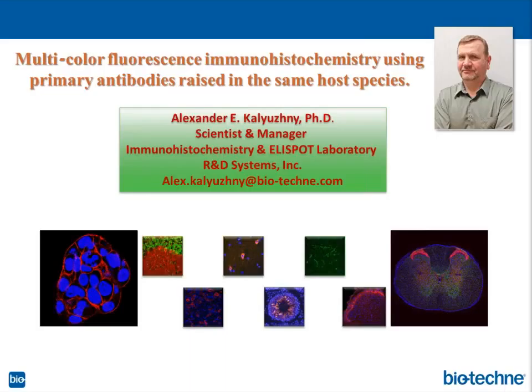We know from published papers that in frozen tissue sections, antigens are preserved better than in paraffin-embedded ones, and that's understandable because when tissues are embedded into paraffin, the conditions are pretty harsh. It's high heat and all the solvents used to embed tissue into paraffin. Whereas in frozen tissue sections, you fix tissues and then cut them on the cryostat and do staining. They are more gentle, I would say.